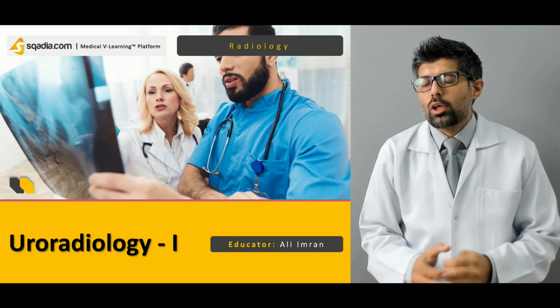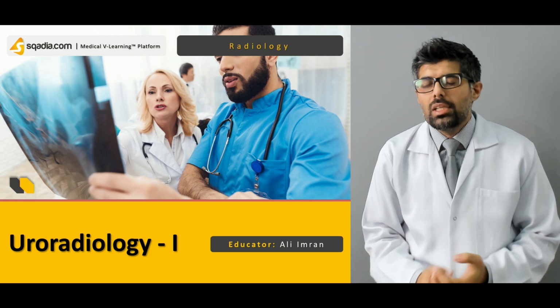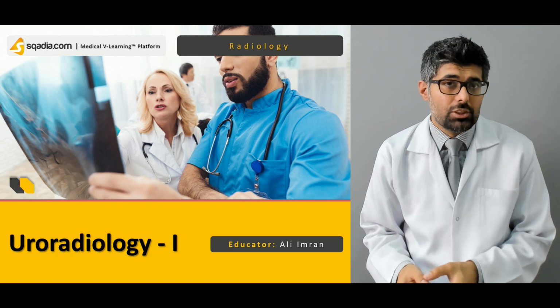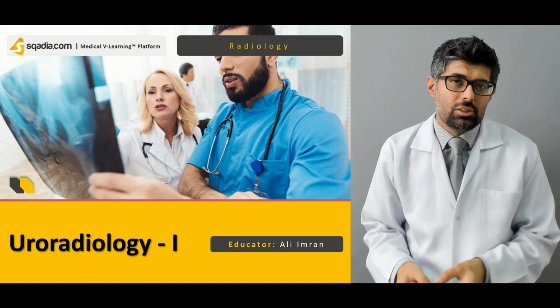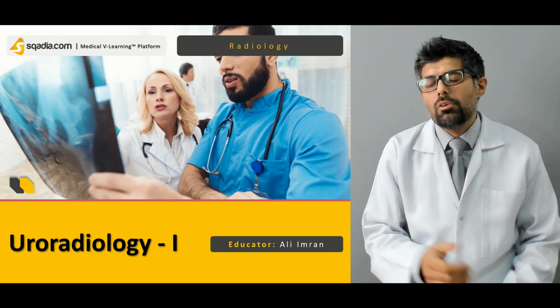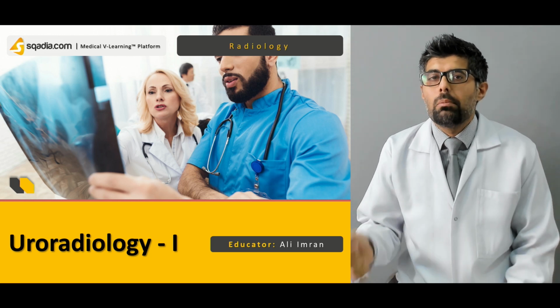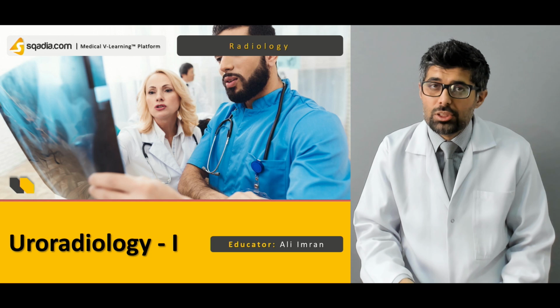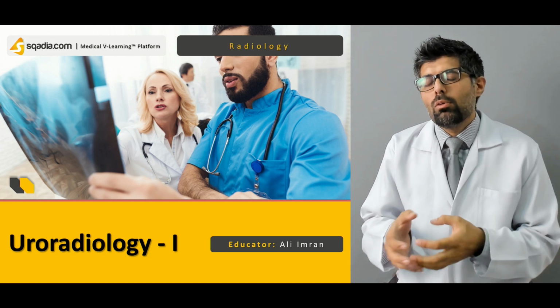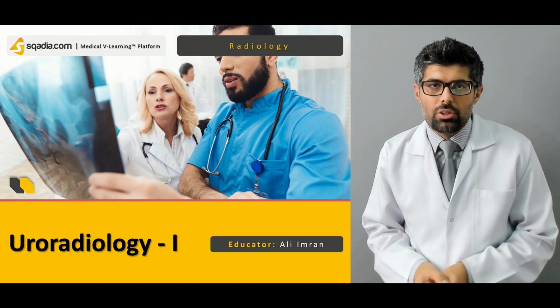So today the topic of our lecture is Uroradiology Part 1. In this lecture we will be studying the male and female urinary system and the male genital system. Now for the female genital system we will have a separate lecture called the imaging of the female pelvis, and in that we will discuss the female urethra. But for this lecture, we will only study the male genital system and the male and female urinary system.